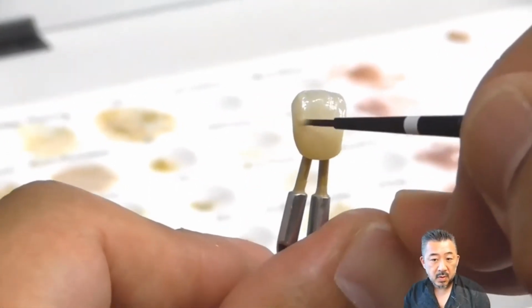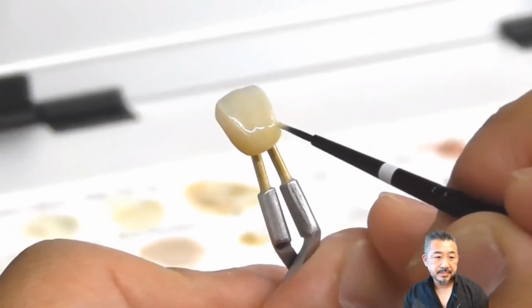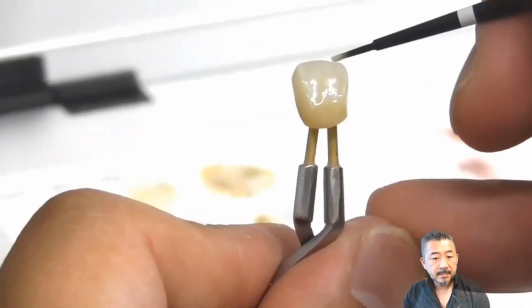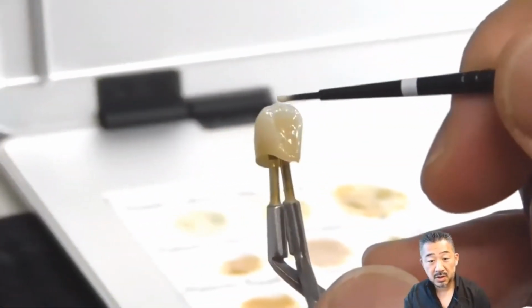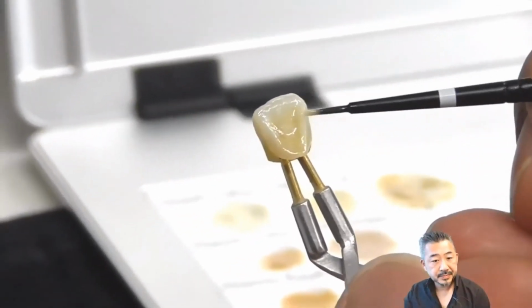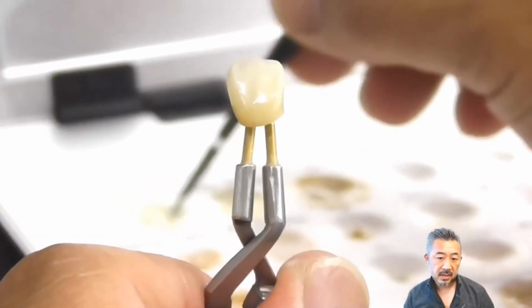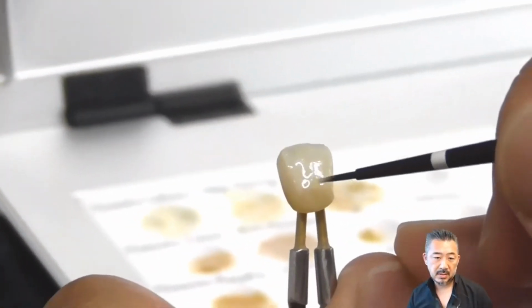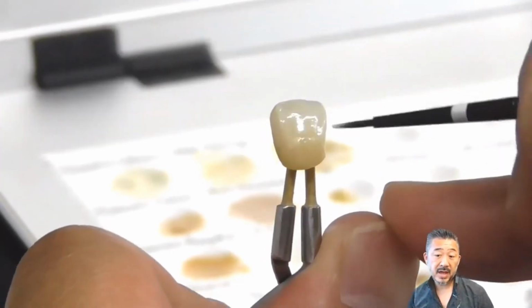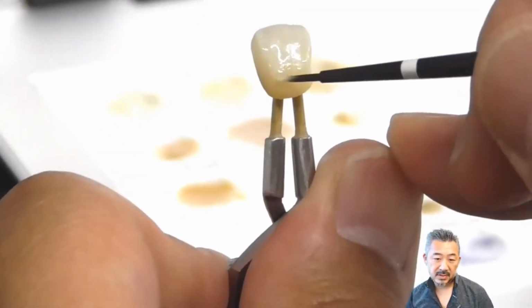If you want to reproduce a white band, use a whitish high opacity paste. So here I applied more gradation than the standard edge color, and the character is also emphasized. Well, that's all there is to it. Regarding the external stain, it's okay to apply it all in one bake, but I think it's difficult to apply it well, right? In most cases, I fire it twice or three times.